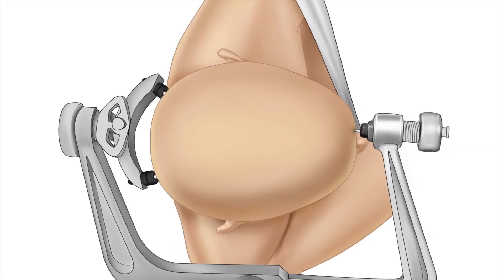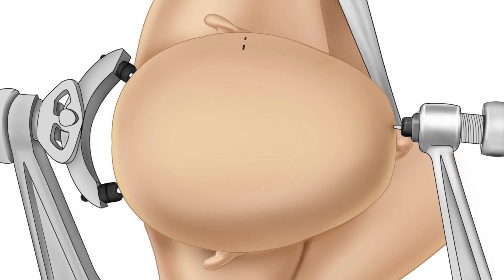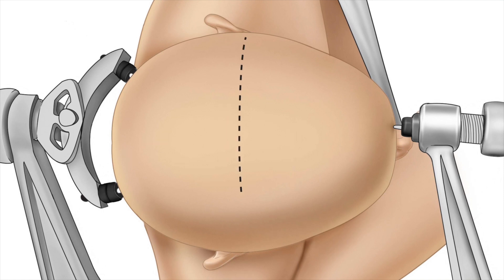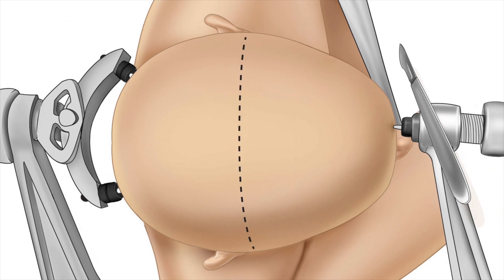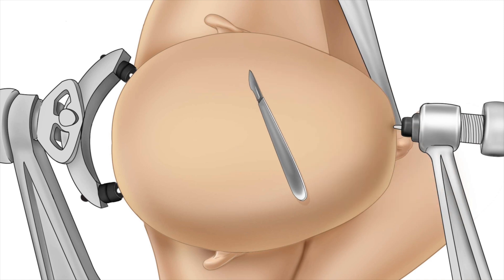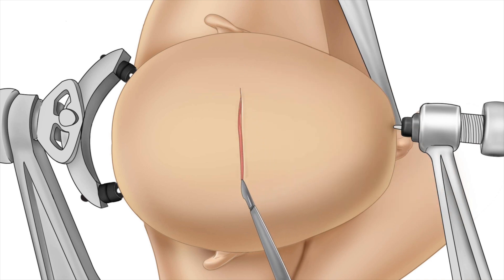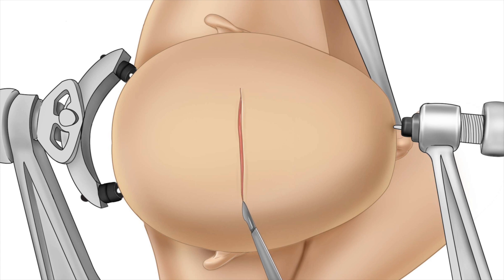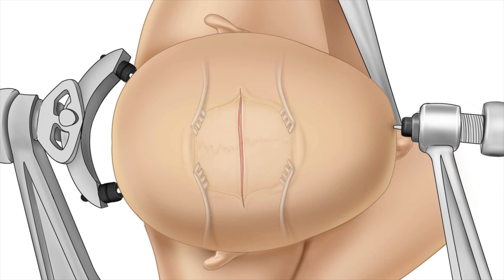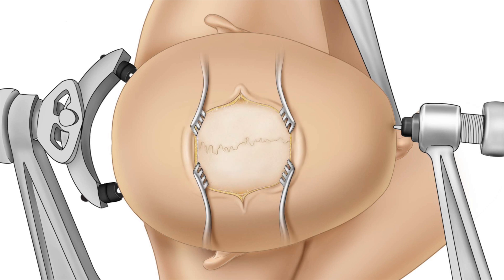Once our patient is positioned, we next turn our attention towards making an incision. We use the location of the coronal suture, which is a natural fusion point between bones of the skull, to center our incision. A scalpel is used to incise the scalp, and retractors are placed to provide exposure of the underlying calvarium, or superficial skull.